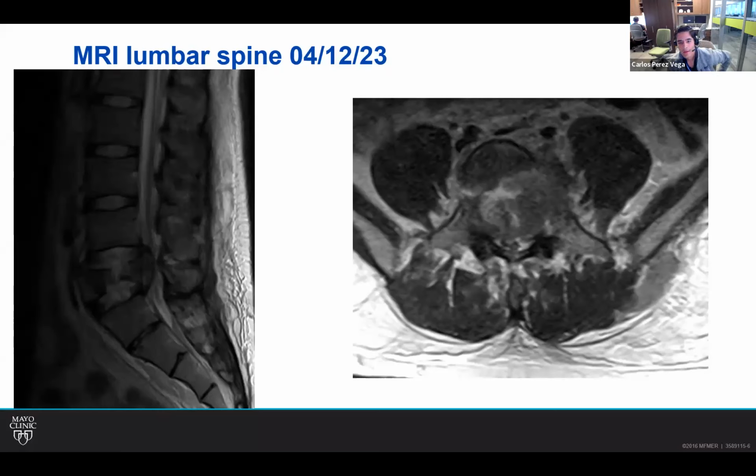And in the axial, you might see also some compression in the spinal nerves going through the spinal roots. They're right there. On this axis it's a bit tricky because you can see the canal, but I haven't shown you the foramen to comment on the exiting roots. You can comment on the traversing roots here. You can see how there's complete effacement of the canal, with basically no CSF signal here.